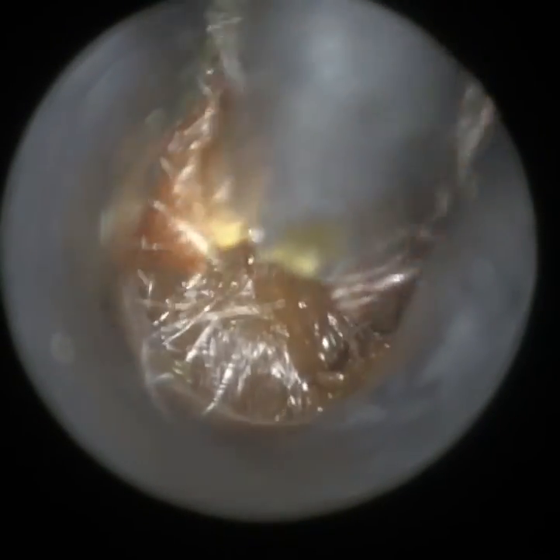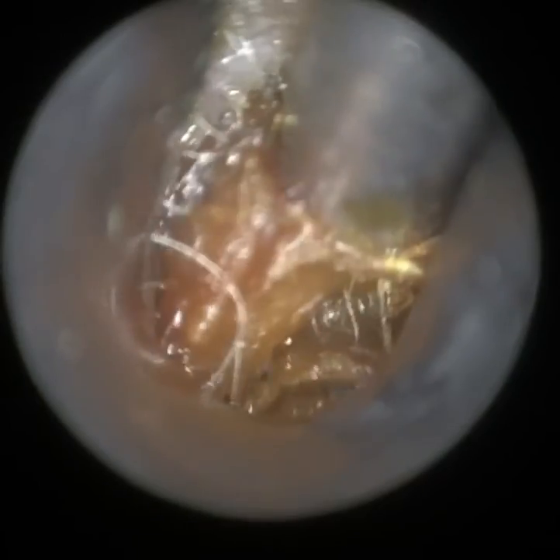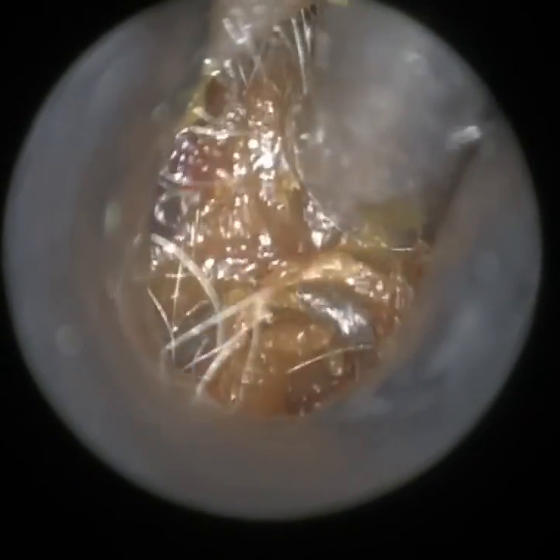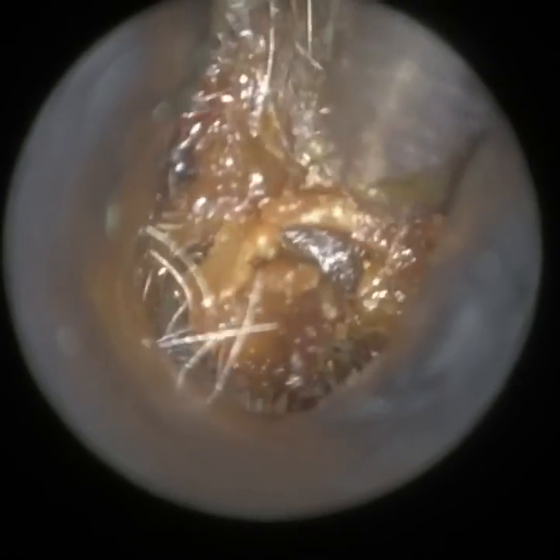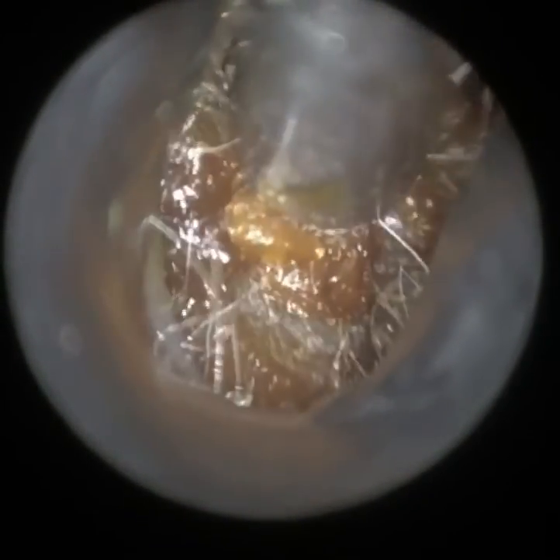I've just brought this to the entrance, but the entrance is completely narrowed and really collapsed. The speculum really helps to open up and dilate the ear canal entrance — I need to be able to do that to remove this wax plug, because now it's stuck at the entrance. If I can't dilate the ear canal entrance, this wax plug is not going anywhere — it's going to be trapped in there.